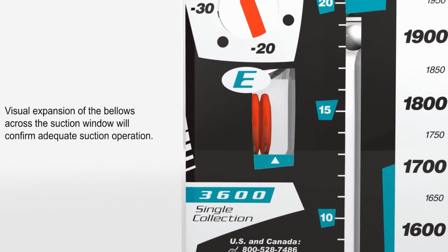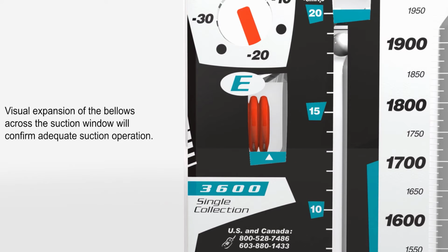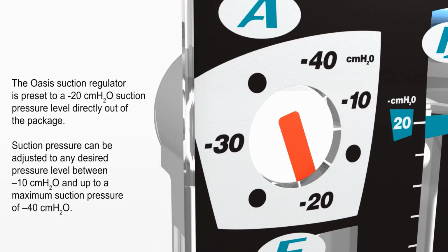Visual expansion of the bellows across the suction window will confirm adequate suction operation. The Oasis suction regulator is preset to a -20 centimeters of water suction pressure level directly out of the package. Suction pressure can be adjusted to any desired pressure level between -10 centimeters of water and up to a maximum suction pressure of -40 centimeters of water.